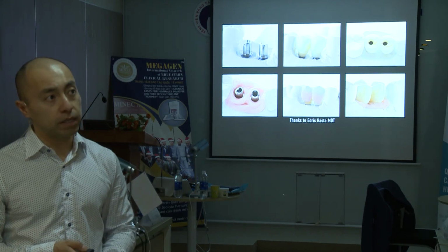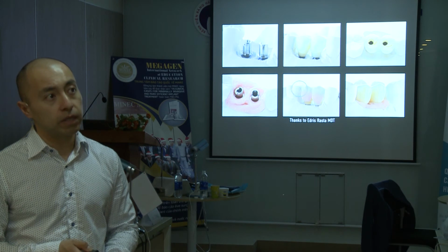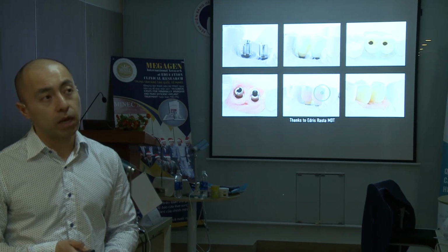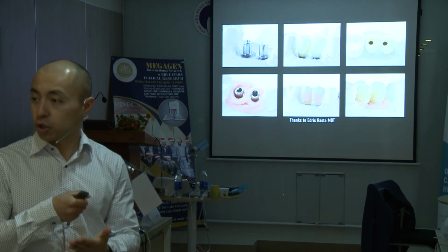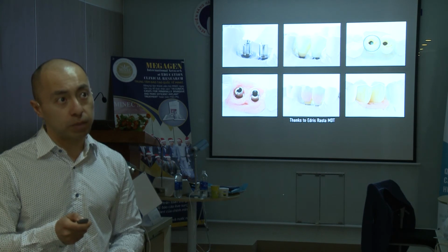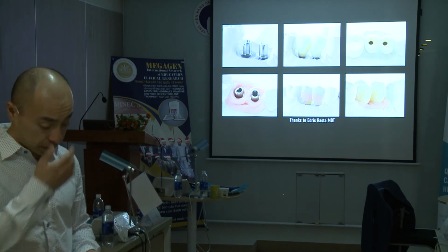So what my dental technician does, again the titanium inserts with the soft tissue emergence, he just puts a layer of porcelain on the buccal part, not the occlusal, the buccal. The buccal never fractures because people don't chew on it. The fracture comes more at the cusps. So this is full zirconia. This is a little bit porcelain for the aesthetics.